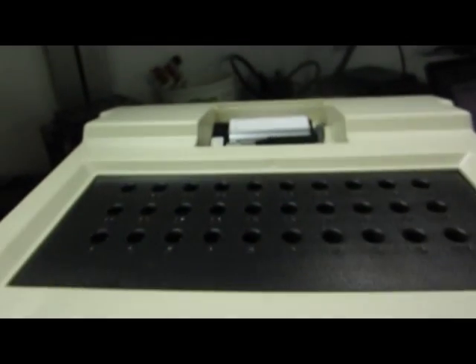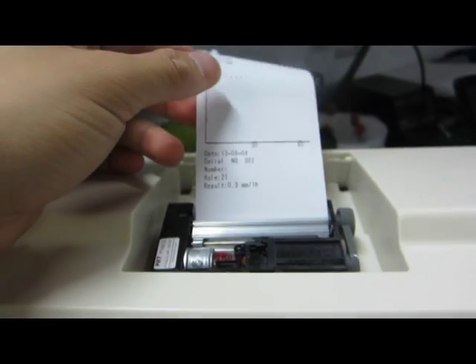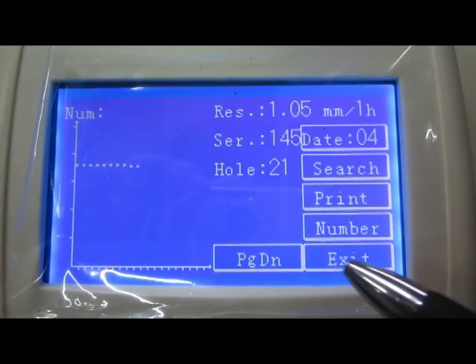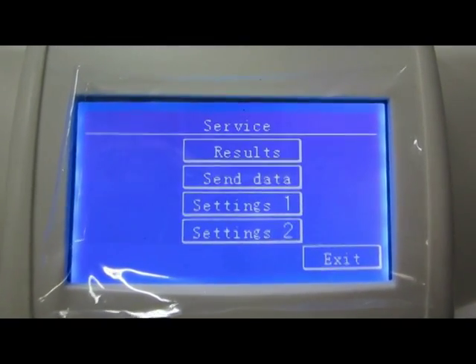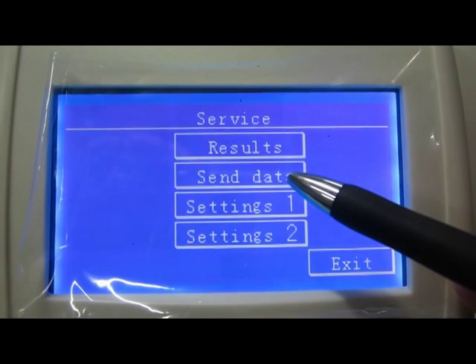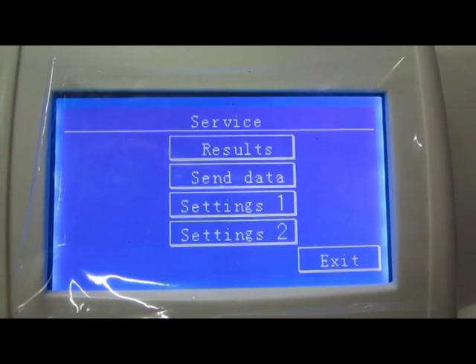And click print to print out the result they want. Click send data to transfer all data to a laptop directly.